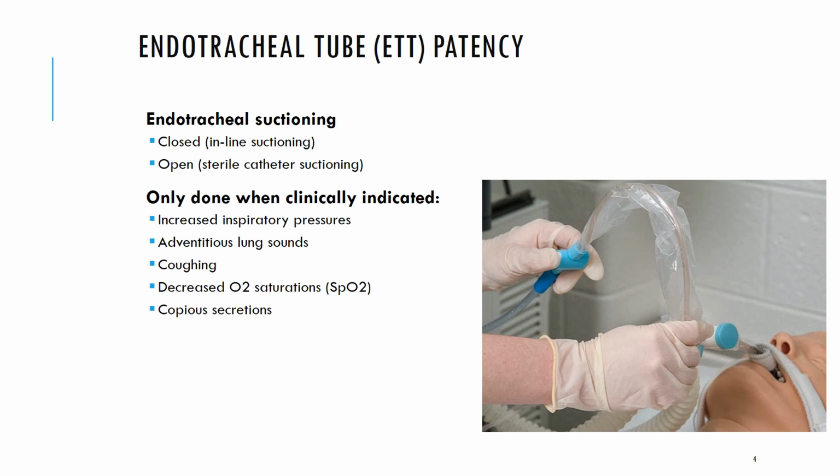So when do we suction? The key thing to remember about suctioning is that it's stressful for the patient. Yes, we're helping them clear their airway and keep their endotracheal tube patent, but the thing to think about is what it must feel like to be suctioned. So we should only be suctioning when it's indicated, not on a routine schedule, not every 2 hours, not every 4 hours, not just because. We should be suctioning when it's indicated.